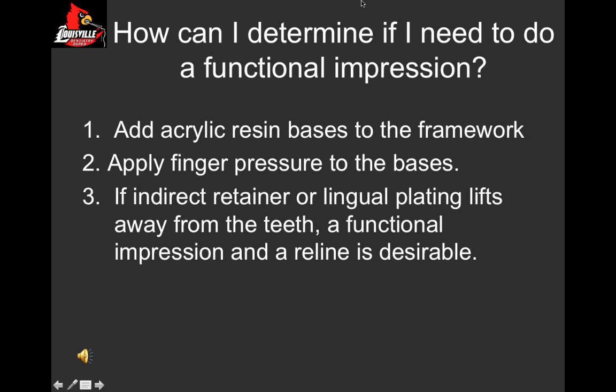How can I determine if I need to do a functional impression? First of all, you can take your framework and add acrylic resin bases to it, and then apply finger pressure to those bases. If the indirect retainers or the lingual plating lifts away from the teeth, a functional impression is desirable.